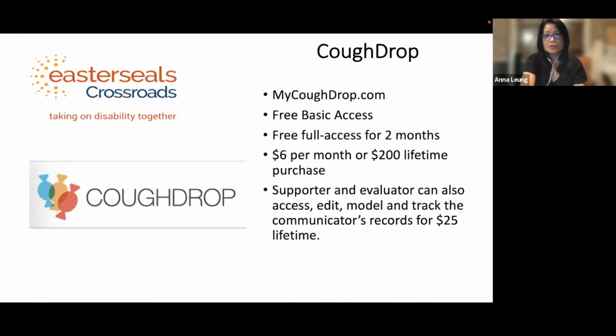The website you can access to learn more about it is mycoughDrop.com. You'll find that there's a sign-in button at the upper right corner that I'm going to show you later. You can find basic access for free. Basic access means it's a little bit limited. If you want full access, you can try out 2 months for free first, and then after that, you pay $6 a month. You can also pay $200 for lifetime, one-time payment, lifetime access.